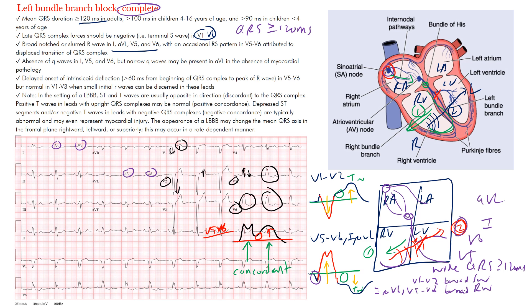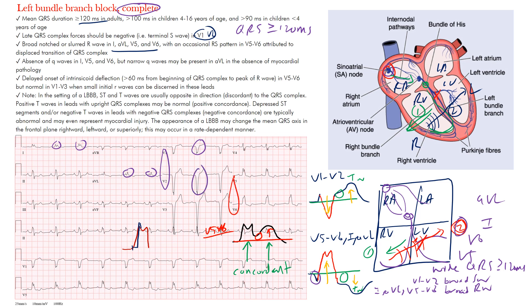There may also be a delayed intrinsicoid deflection — the time from the beginning of the QRS to the peak R wave in the left lateral leads — which may be delayed over 60 milliseconds. This means there is a delayed upstroke from the beginning of the complex to its peak. The main findings to recognize are those deep S waves in V1 and V2 and the broad or notched R waves in V5 and V6 — almost the opposite of what you see in right bundle branch block. This pattern is pathologic and important to be aware of.